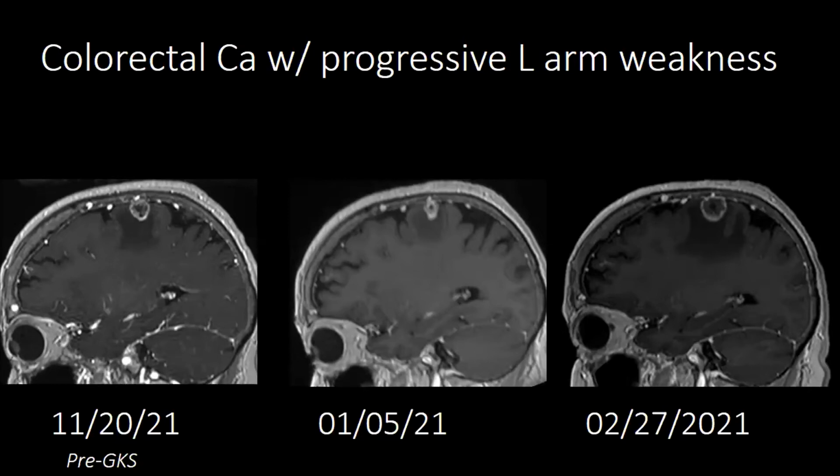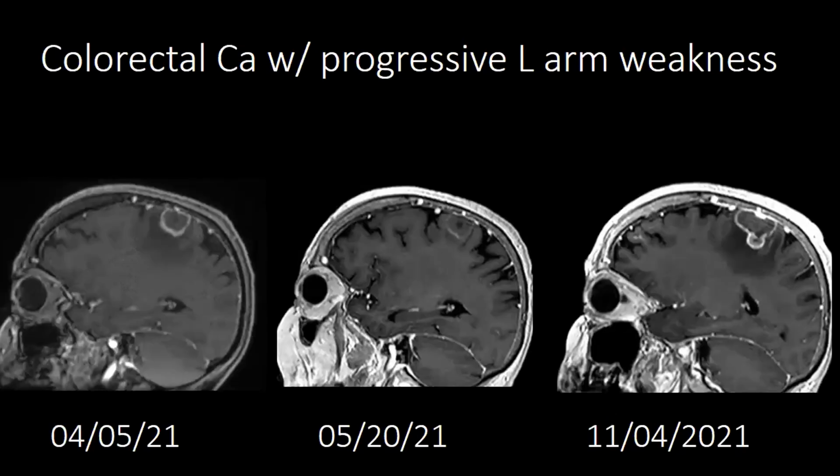The patient received gamma knife on 11/25/21, and the follow-up, which should be 22, so apologies for that, the patient did get smaller, the lesion did get smaller, but then on the follow-up scan, it increased. What is this? We did not know, but because the patient was having symptoms, they put him on chemotherapy, or I think Avastin is what it was. So the follow-up imaging, this time he was still increasing. This is during Avastin, and then suddenly you have a larger lesion and you have a little excrescence over here. Could this be radiation?